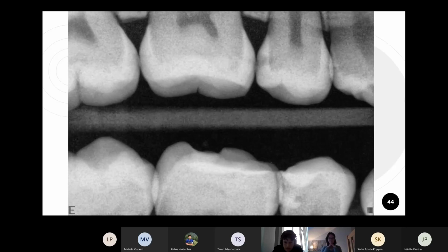So either you should probably take another bite wing from a slightly different angle, so they're not overlapping. That's not usually the case, though. It should be in a bite wing that you can see your upper and lower quadrant properly. But in this case, the lower jaw teeth were slightly overlapping in this angle of the X-ray, so you can't really say if there's caries, but it doesn't look like it. Maybe between 4.6 and 4.5, there's some shadows there. Pardon me, radiolucencies. But yeah, you would probably have to take another X-ray for this.